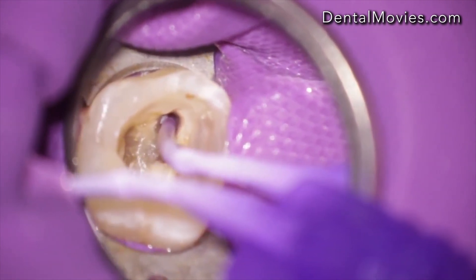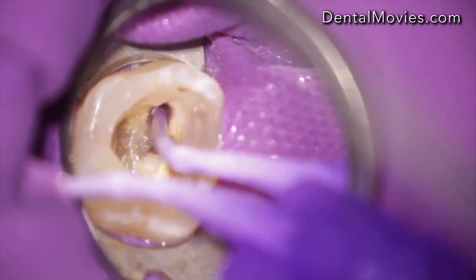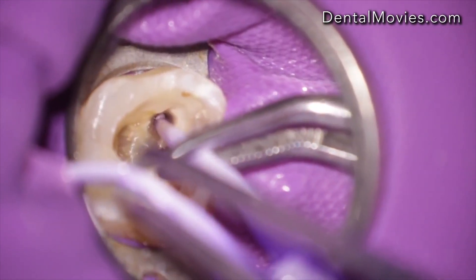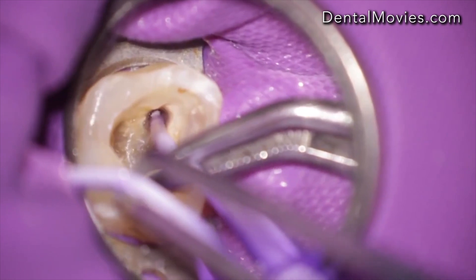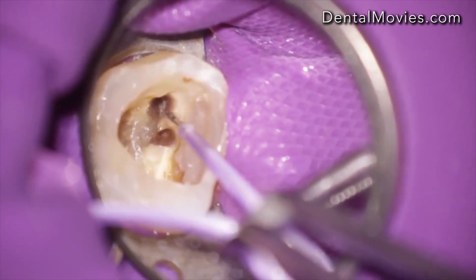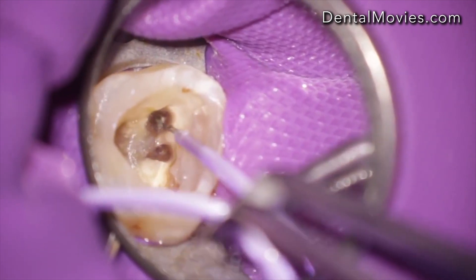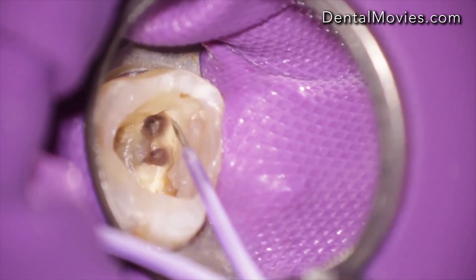The 10 minutes are over, and now you can remove the instrument very easily. This was the instrument removal with the tube technique.